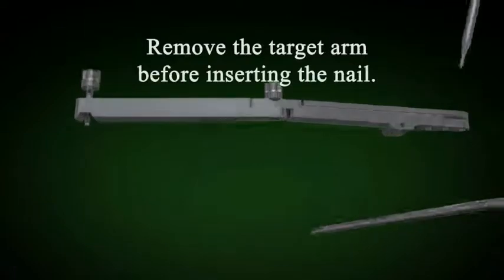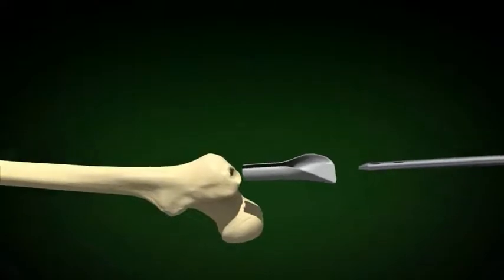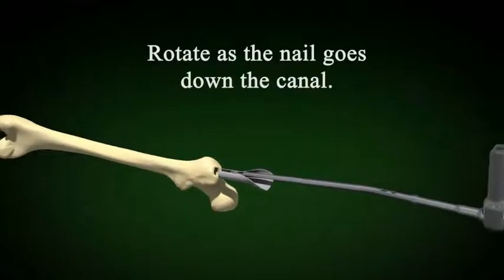Remove the target arm before inserting the nail. The nail is inserted using rotation. Please use the tissue protector so that the nail does not touch the skin.